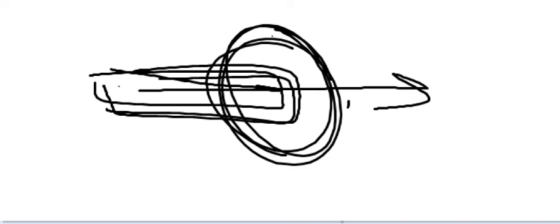It's the rate of the table motion in regard to the tube rotation. If I say pitch 1 to 1, for every tube rotation, the table moves 1 centimeter, for example. 1 to 3, for every tube rotation, the table moves 3 centimeters. The more the pitch, the faster the acquisition, but the less data. The slower the table moves, the more data, the better the image.